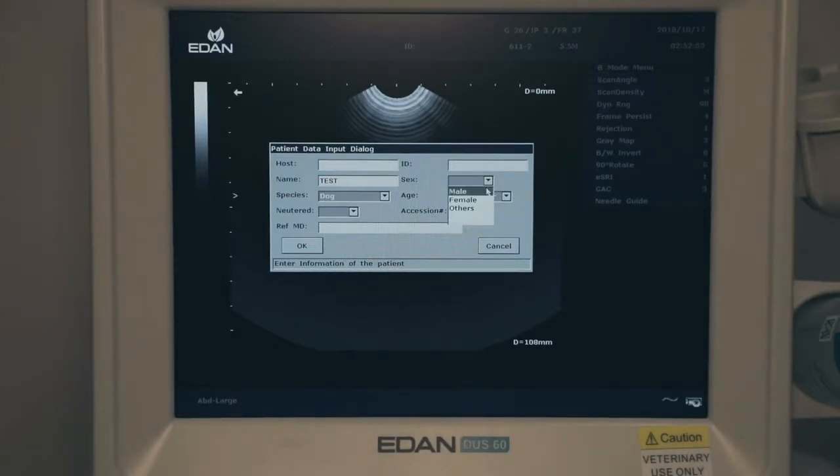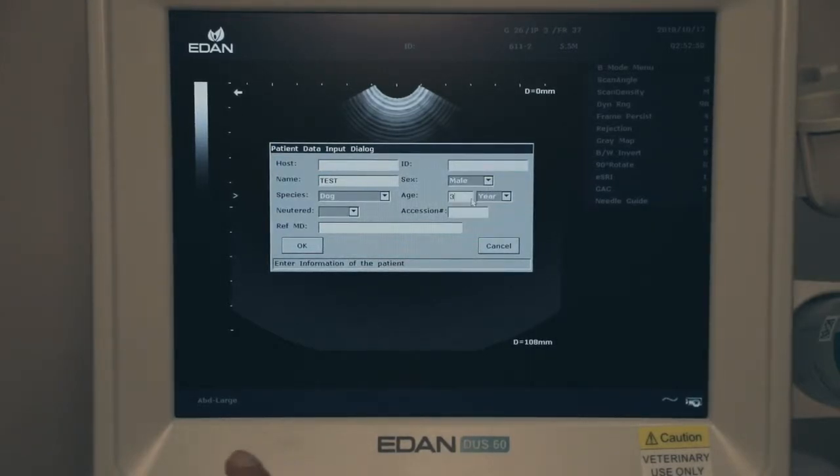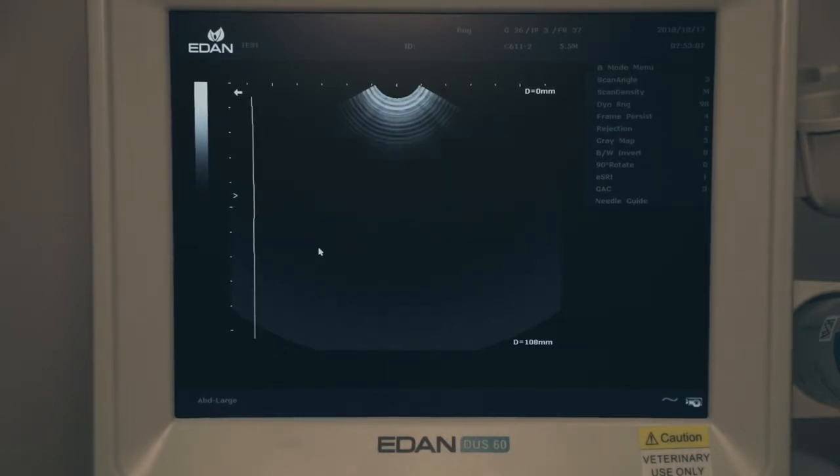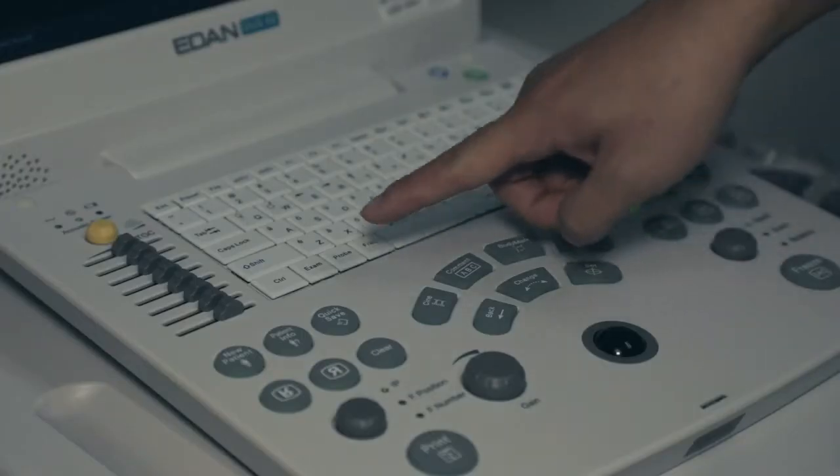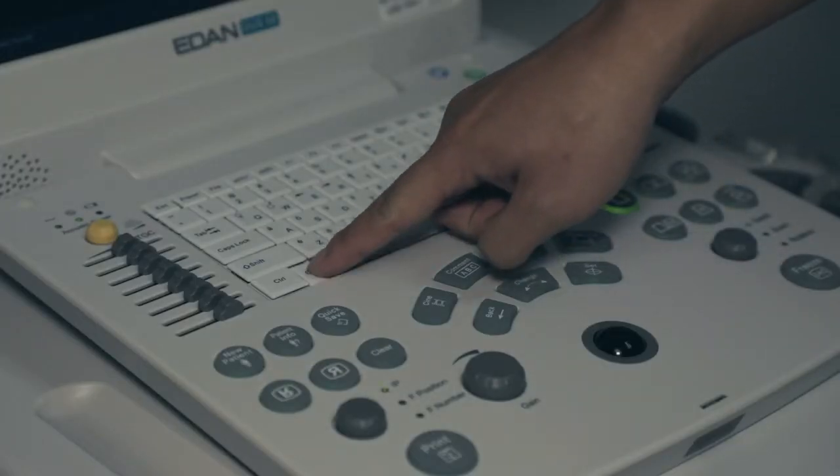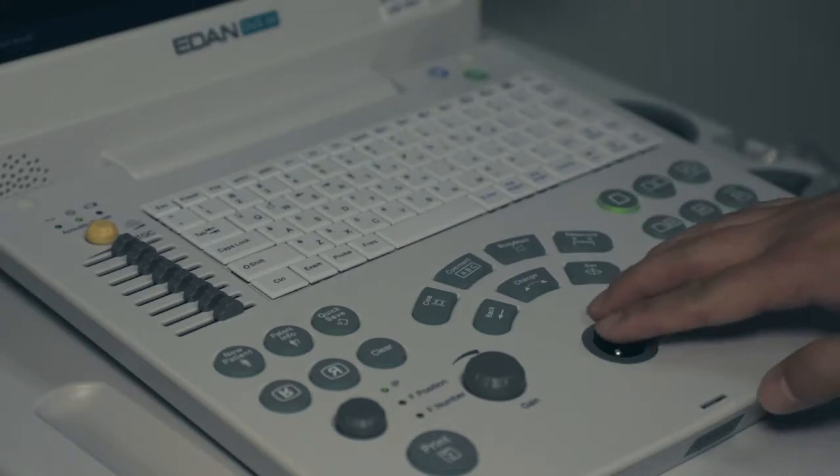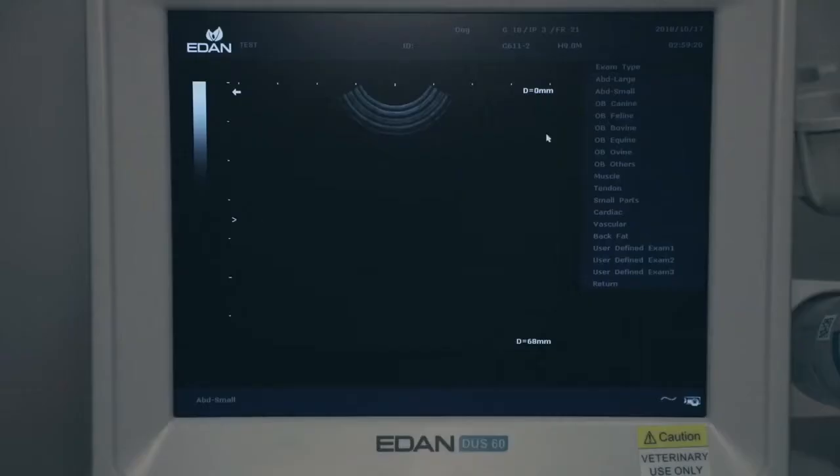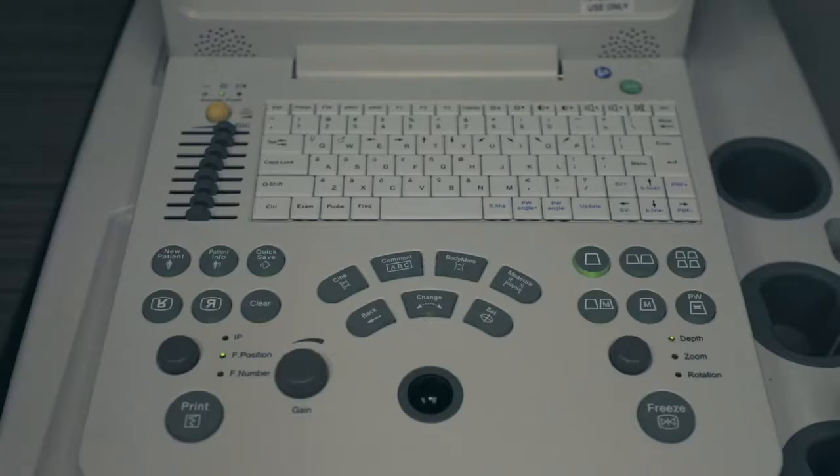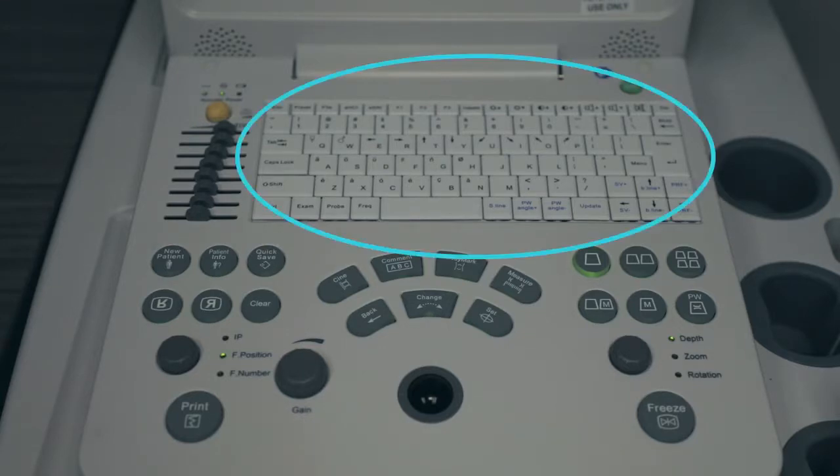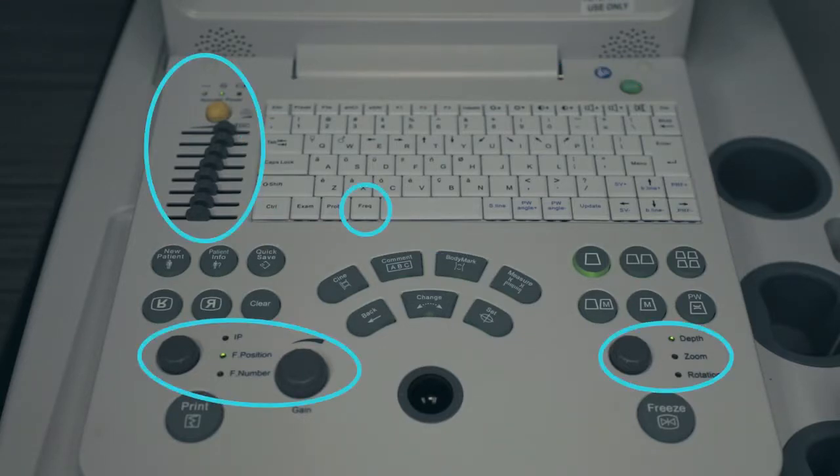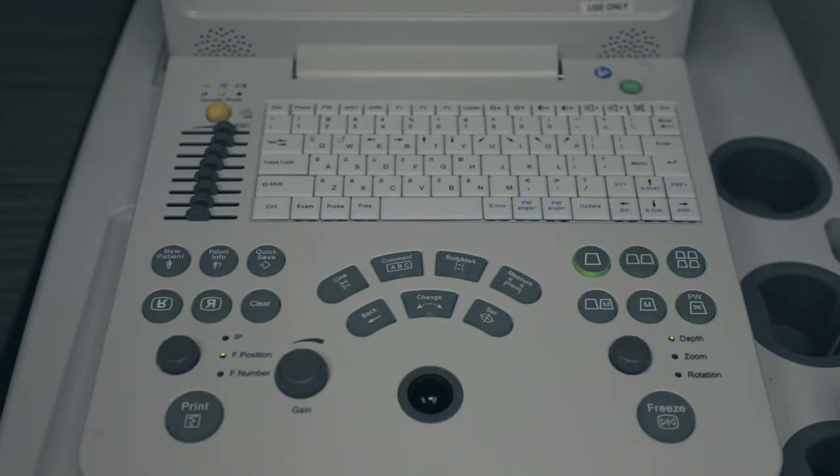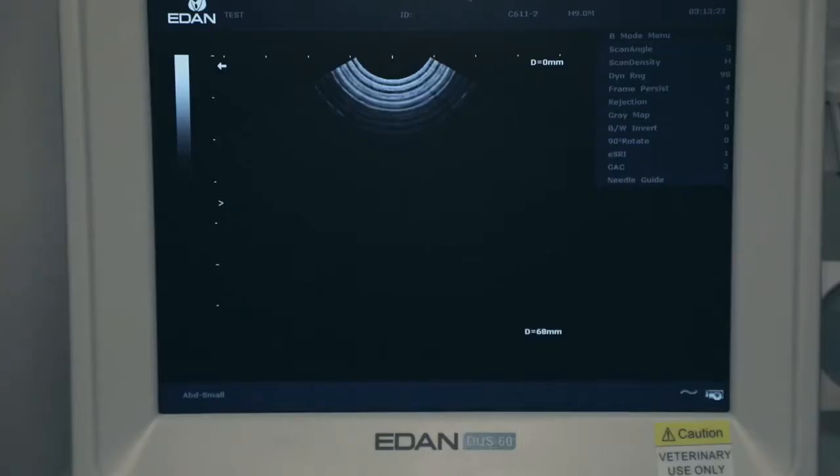Roll trackball to select OK and press set key to confirm. Press exam key, roll trackball to select application, highlight and press set to confirm. Control panel is divided into several sections: keyboard, parameters, functions, and controls. Screen is also divided into sections: menu, image display, coordinate axis, focal point position, and probe indicator.